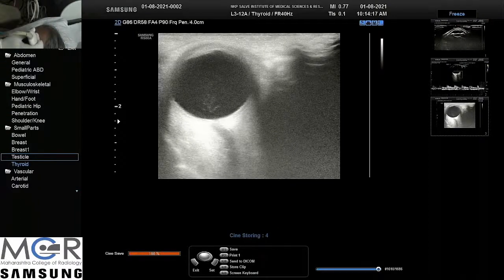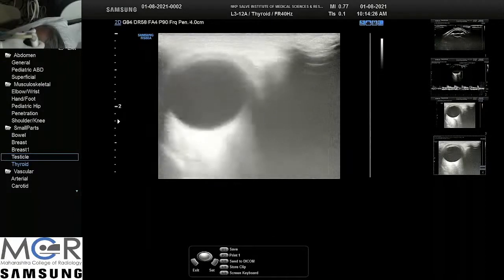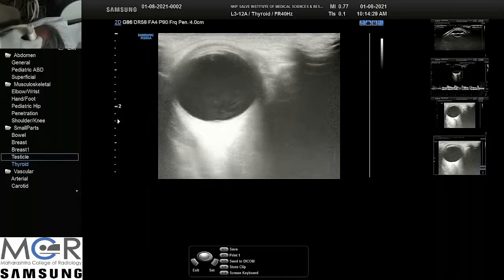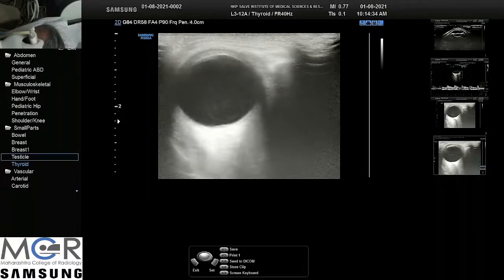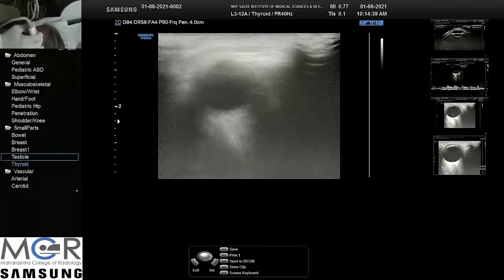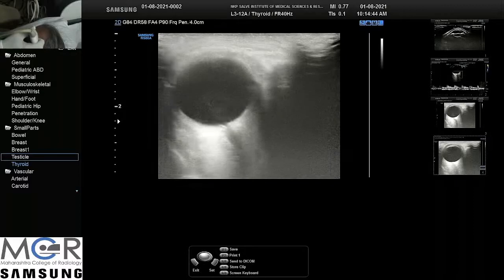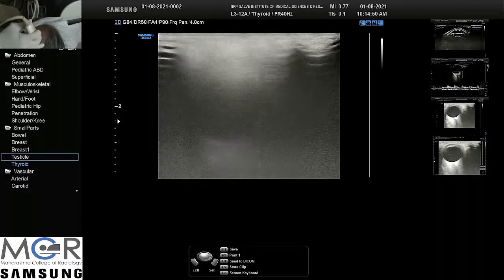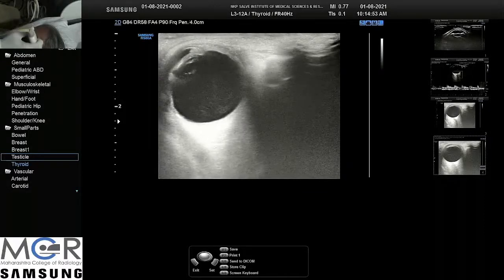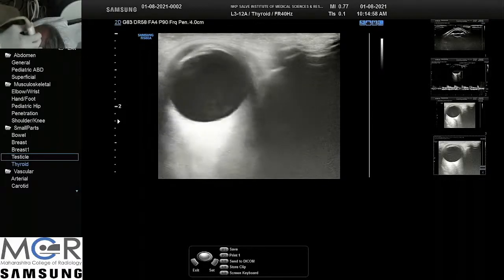This could be a fresh vitreous hemorrhage, or this could be early exudates. We cannot always differentiate between the exudates and the hemorrhage, as is the case in other body organs also. For example, in abdominal ultrasound also, sometimes it becomes difficult whether there is pyonephrosis or just stagnated debris in the dilated system. Likewise, but in view of her anterior uveitis, you can say this could be posterior uveitis also. This could be changes of posterior uveitis.